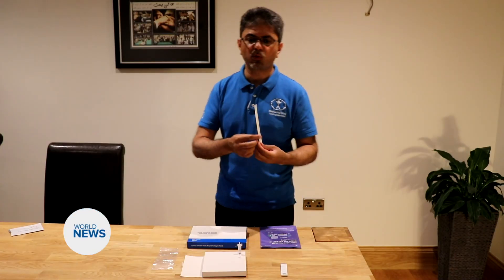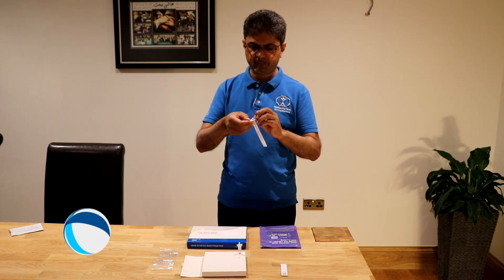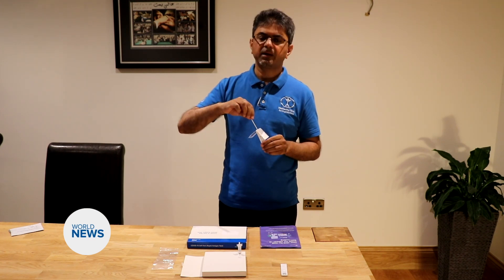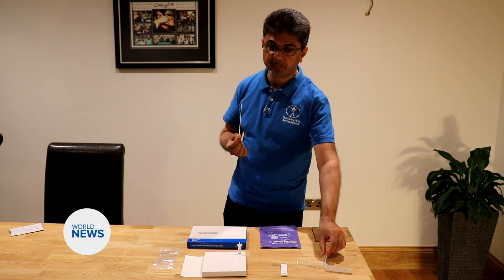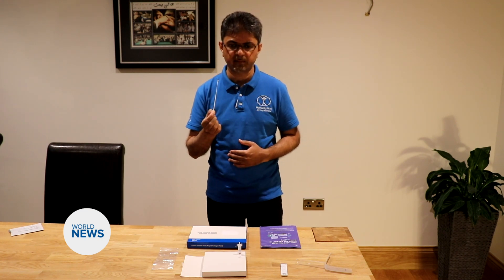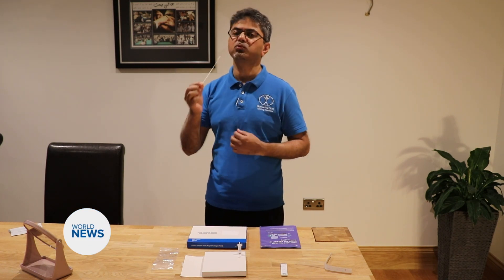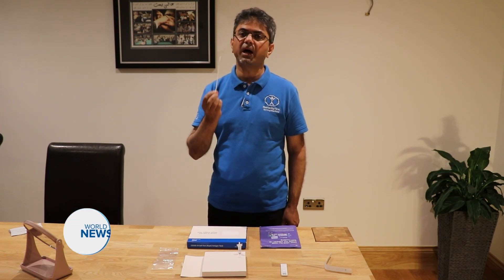We now take the swab and we remove it from the sterile packaging. Remember this test can be slightly uncomfortable, however that is entirely normal. Ensure that the fabric end of the swab does not touch anything else — your teeth, tongue, or gums. Place the swab between your fingertips, use a mirror to help you, open your mouth nice and wide and rub against the tonsil area four times like this.